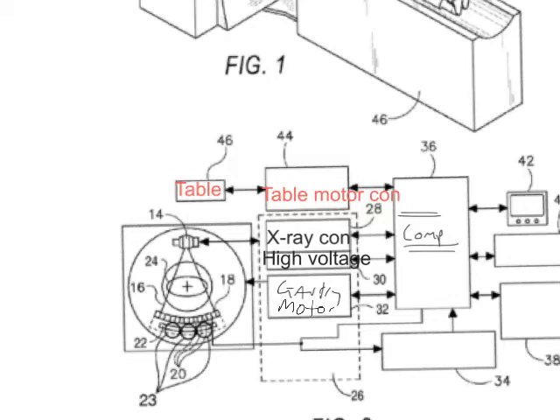All of those seem very important to me, because if I can't move people in and out, people freak out, right? If you can't get a person out of this machine, they don't like sitting there.